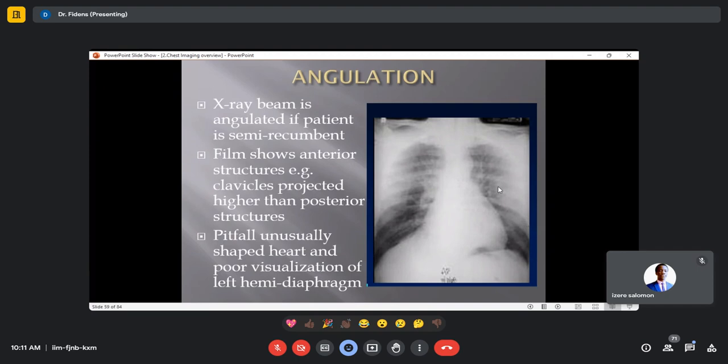and that is somehow okay, and I can understand you. That's somehow how the physics is, the physics of the X-ray machine, how it works. I don't know if you have to go into those details of physics for your level.